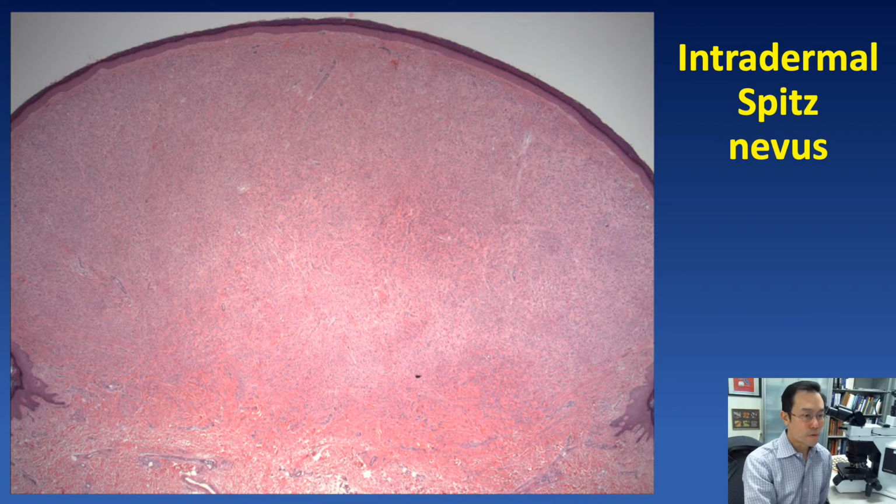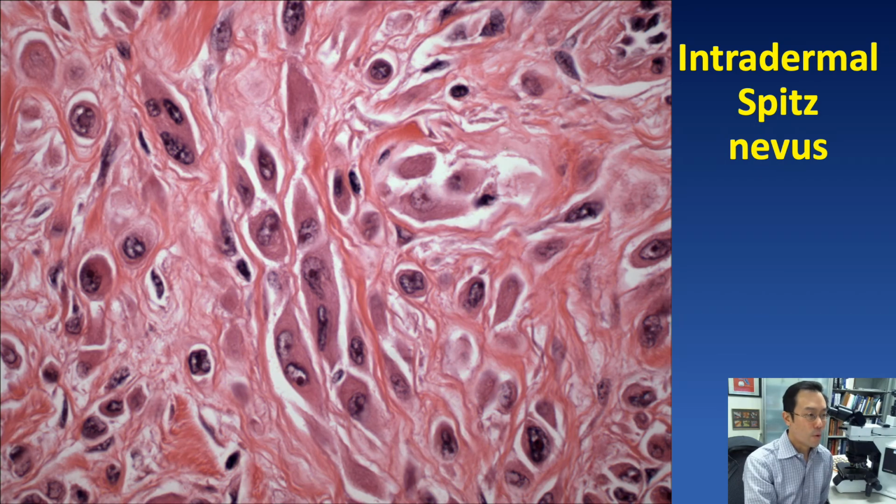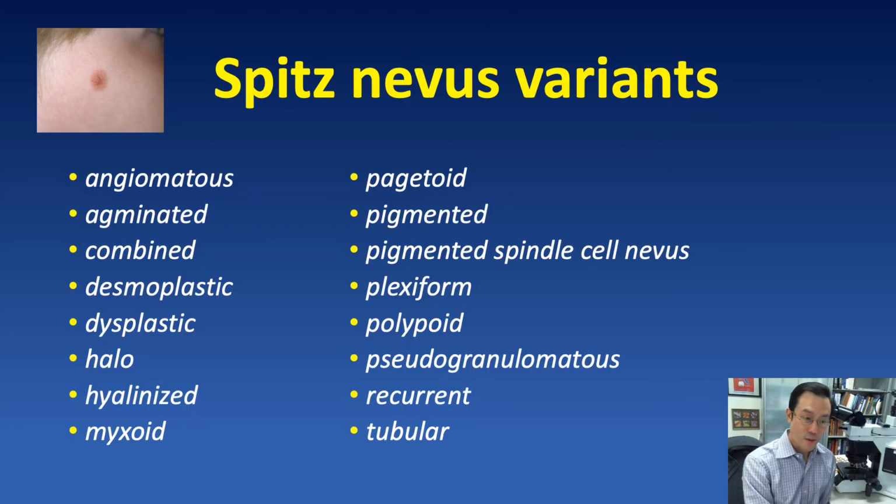Pathologists always prefer complete samplings rather than partial samplings, and there's probably no area that's more true for than for melanocytic tumors exhibiting spitzoid features, wherein a symmetrical circumscribed profile with characteristic spindled epithelioid cytologic features in the classic clinical setting can be quite reassuring. And just so you know, there are, truth be told, many histologic variants of Spitz nevus.